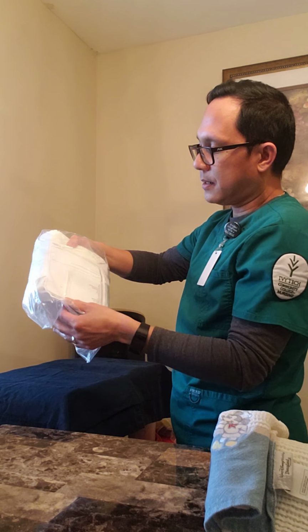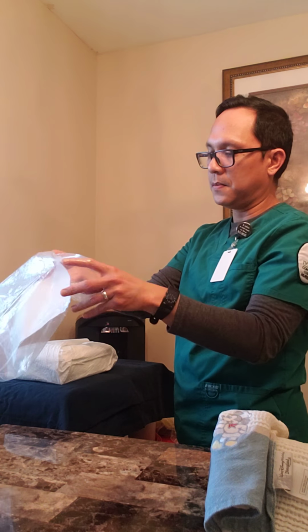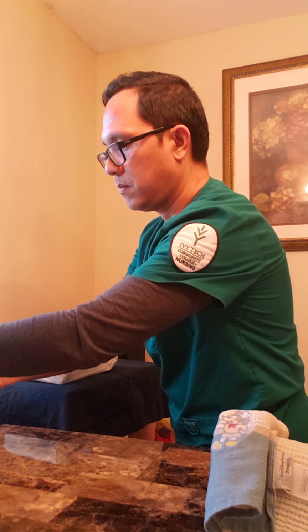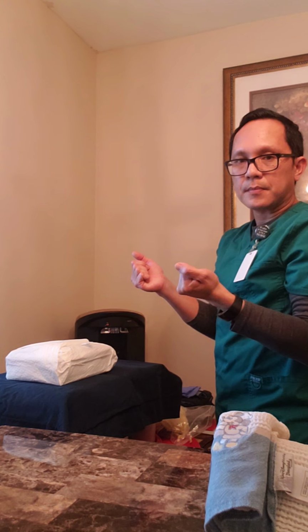Now, I will open the Foley kit. All right.